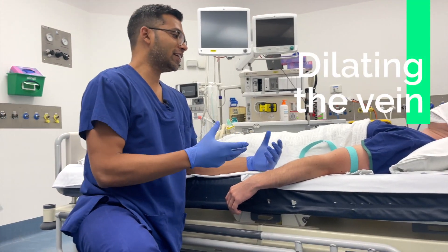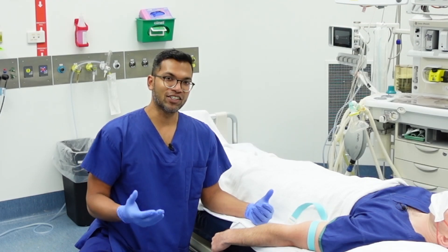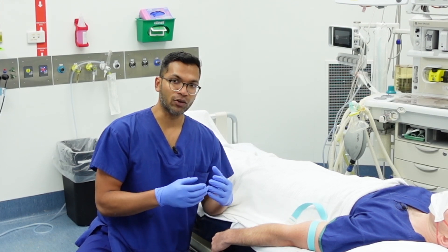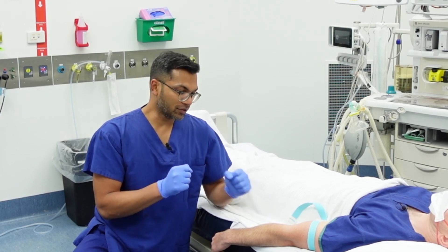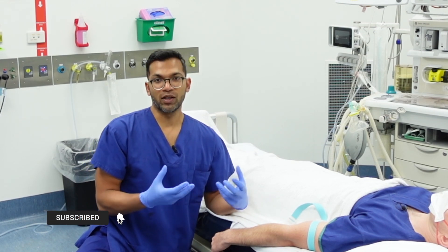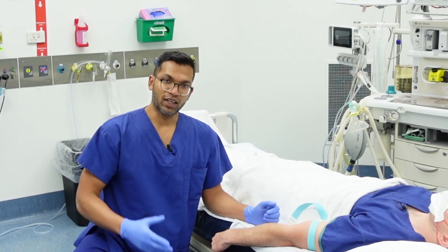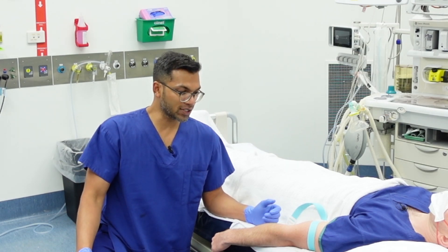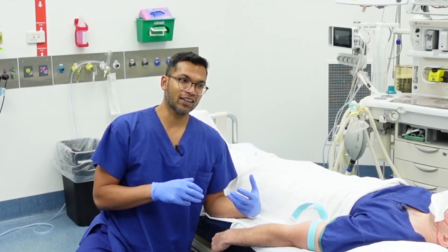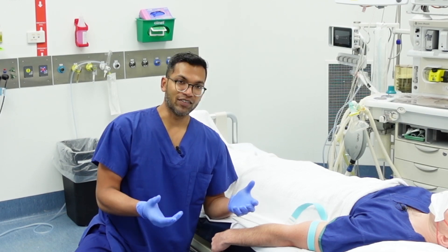Now I'll go through some things to make veins stand out. The first thing is to know your environment. Hospitals are almost universally cold environments — air conditioning in a theatre, for example, is really quite cold. You want to keep your patient warm, because if the patient is cold they will naturally venoconstrict and it'll be very difficult to see the veins, whereas if the patient is warm the veins will vasodilate. I'll almost always have the patient with a blanket on, and sometimes warm towels are useful. I don't use a warm wet towel though, as the water gets cold quickly and as it evaporates it creates an even cooler environment.